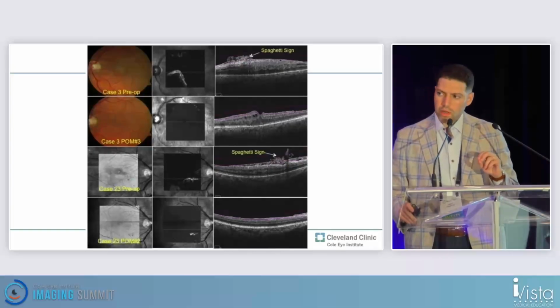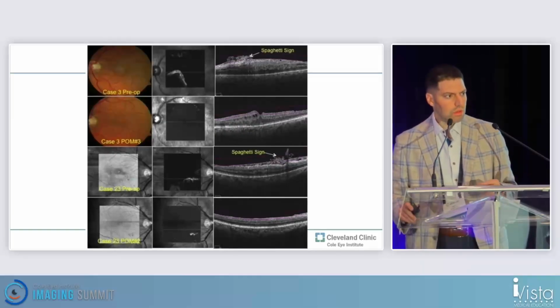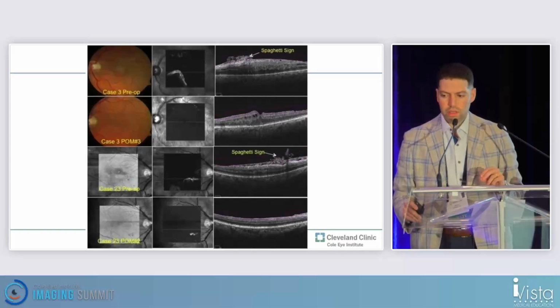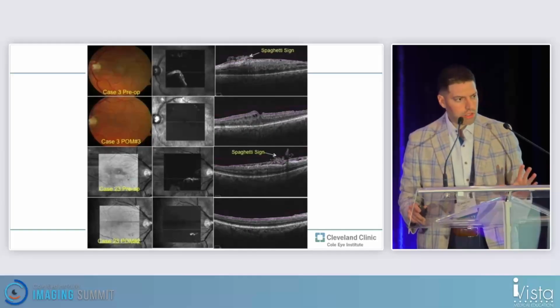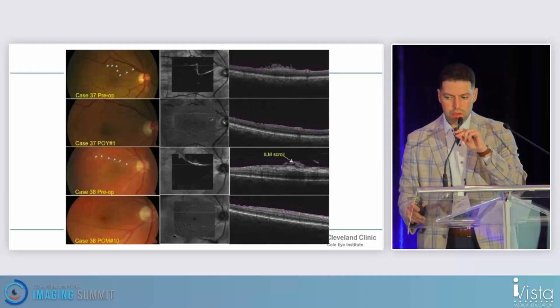And if you're ever doing membrane peels and you're wondering, oh my gosh, this tissue here feels a little bit integrated with the retina, it doesn't seem like real ERM, you're sitting there fiddling around and wondering what you're supposed to do. Well, if you know in pre-op that you actually had schisis of the RNFL, you would kind of know what area it might be in and pay close attention to it. These areas I don't touch when I see them in the OR. That top picture is showing you how they look with that little yellowish appearance. I don't touch them, and they end up totally resolving post-operatively. Here are some other examples from their case series.